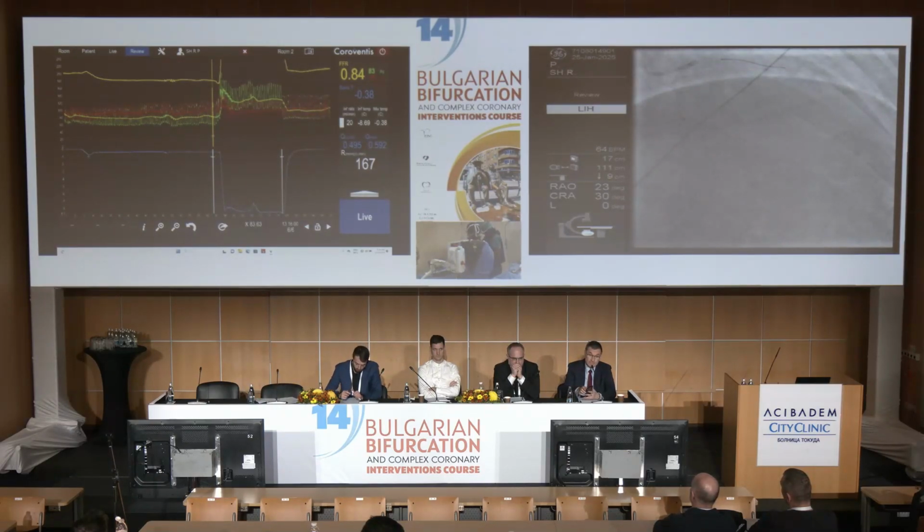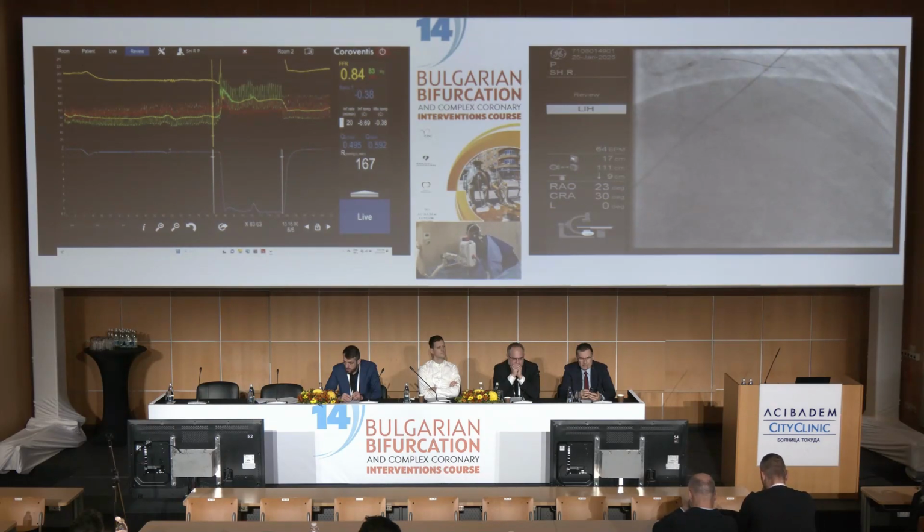Yeah. There is a very small detail. Look at this. You see how the lower the line, here, there is something which happened here with the signal. Why did it happen? Well, probably there has been, for some reason, a small bump in the pressure.